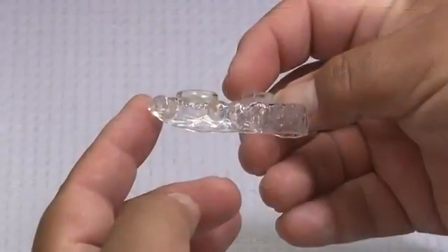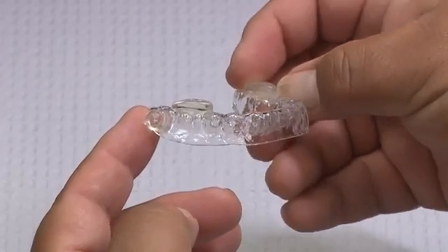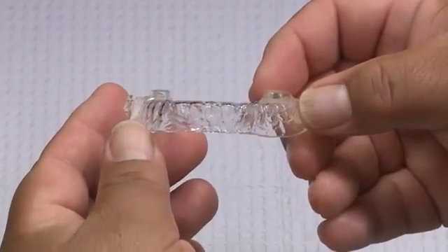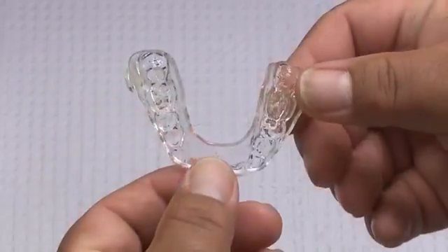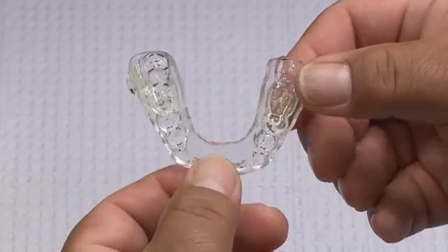The finished lines for the lower should appear as follows. Posterior buccal, approximately 3 to 5 mm from the gingival. Anterior facial, at the gingival line. Lingual, approximately 5 mm flat from the gingival.